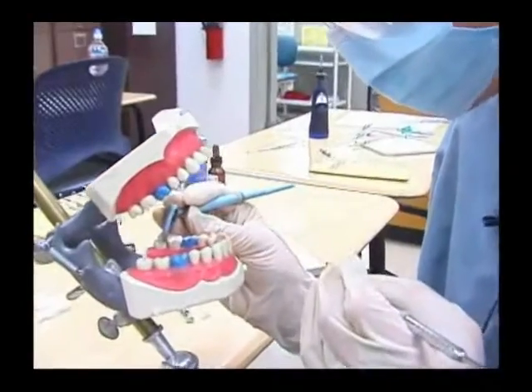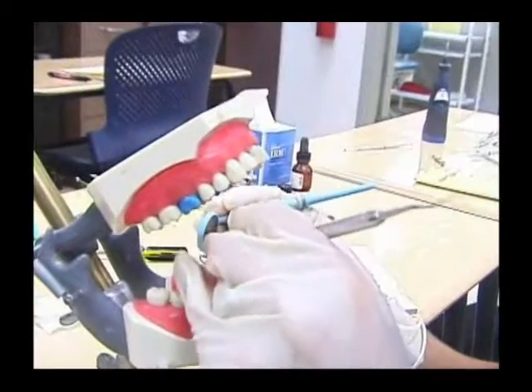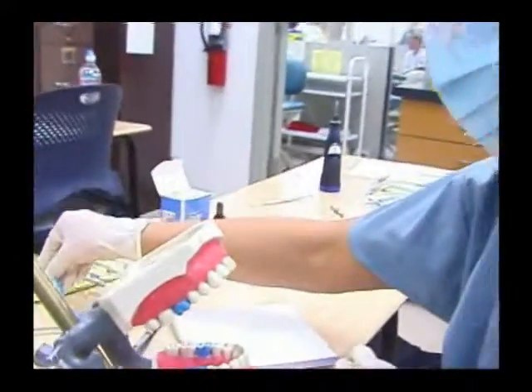With the mirror, you're going to be guiding it. You're going to be checking your interproximal areas, which are the spaces in between the teeth. Make sure that your contacts are closed.